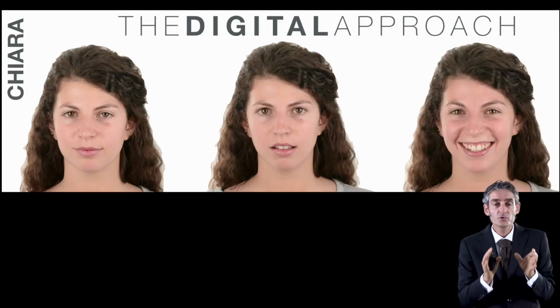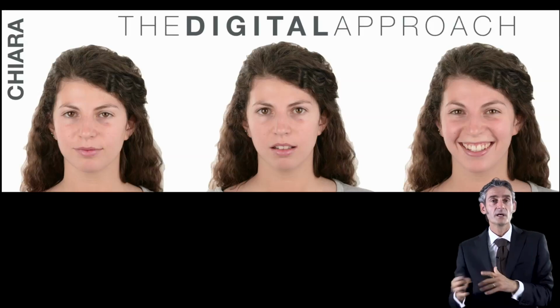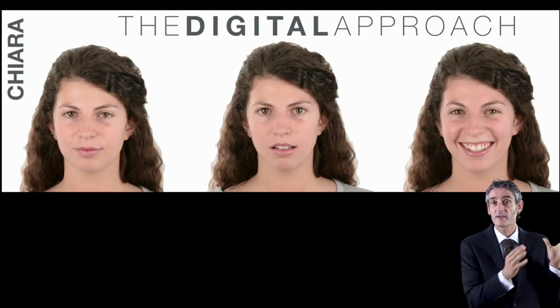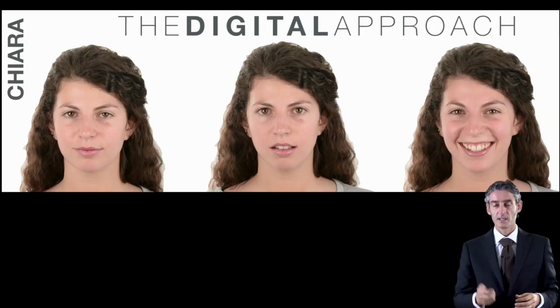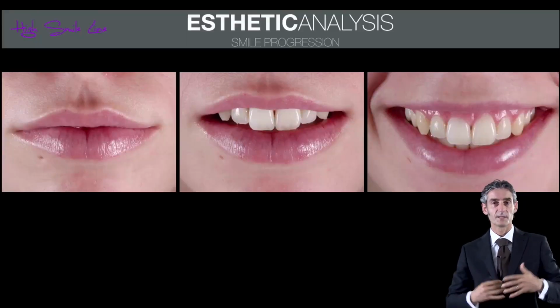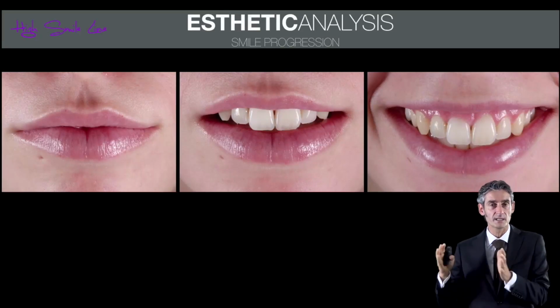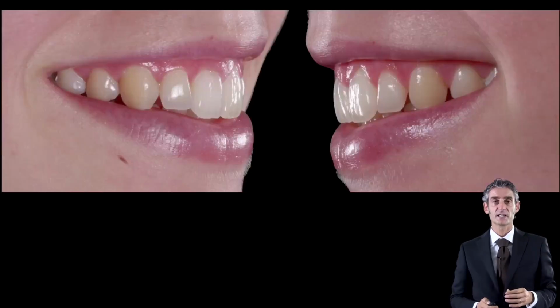Because we are going to copy exactly the neighboring one and the contralateral tooth, for example, in the way to obtain a perfect result if everything is fine. And so we see this patient that came into my office because she has some pain in the central incisor. Looking at the picture and going in a systematic approach, as we do normally in the traditional approach, we can see that everything seems fine and the aesthetic is fine.